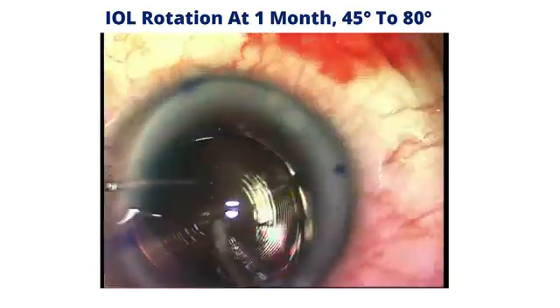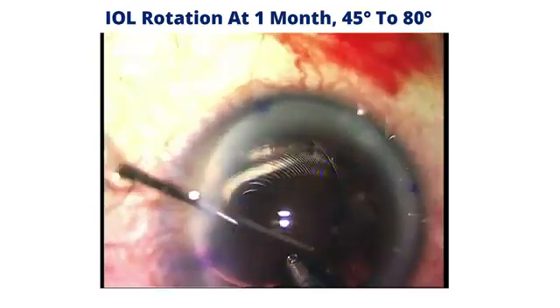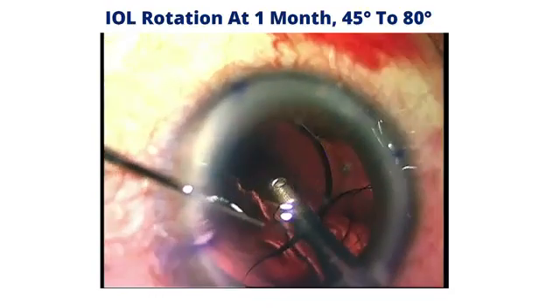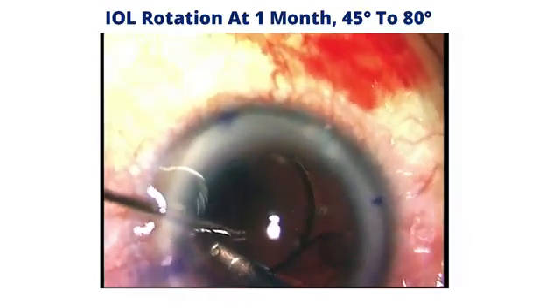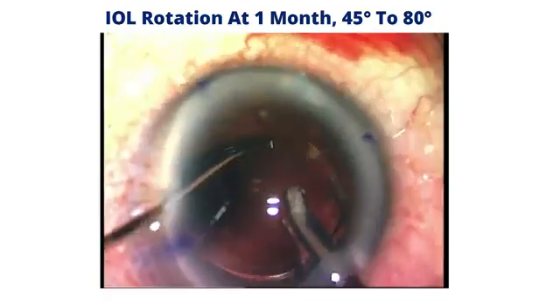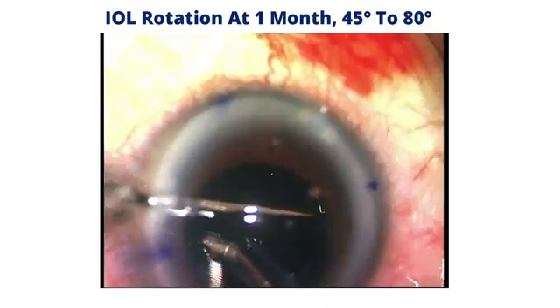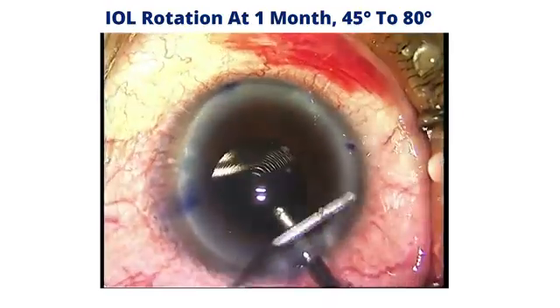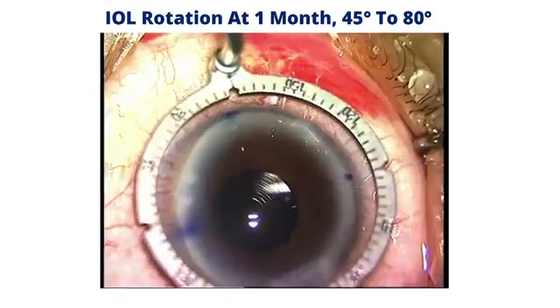This is a plate haptic. I need to really remove viscoelastic from not just the optic but also the haptics, and then just ensure that the incision is nicely sealed. And what you saw was just that suture that I cut, because I was concerned that I may have problems inserting this capsular tension ring, that it may not skirt around smoothly in the capsular fornices, because this is already a month post-operatively, and that suture would just help me to overcome any adhesions in the capsular bag by retracting it and reducing the radius of this capsular tension ring.